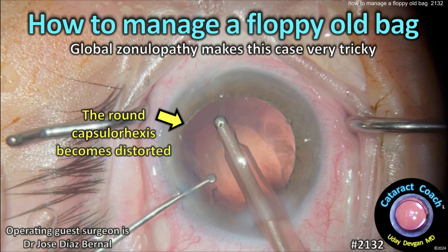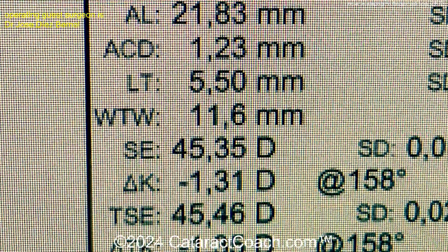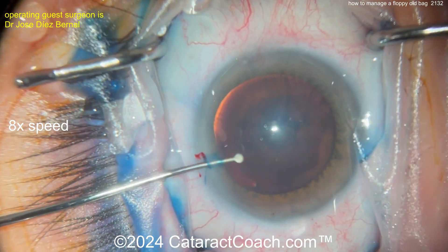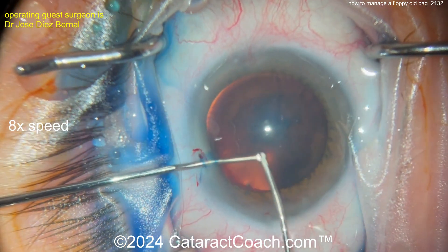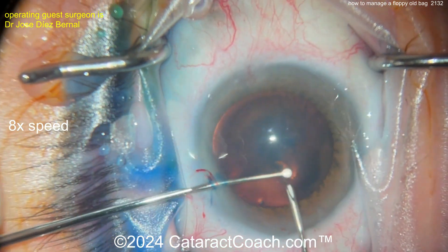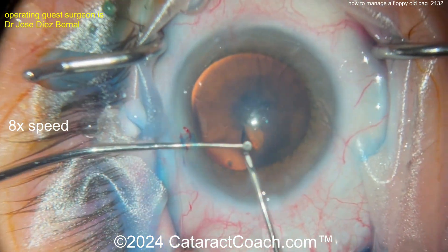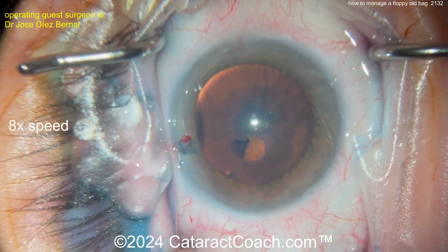CataractCoach.com — how to manage a floppy old bag. Global zonulopathy makes this case very tricky. Watch carefully, this is an interesting case. Look at that small eye: 1.23 millimeter anterior chamber depth, 21 millimeter axial length, and 1.2 millimeter AC depth — so very shallow AC. These tiny eyes are the most stressful ones.